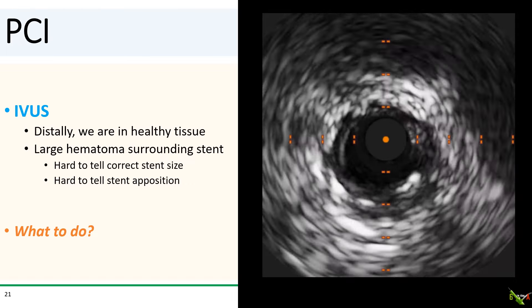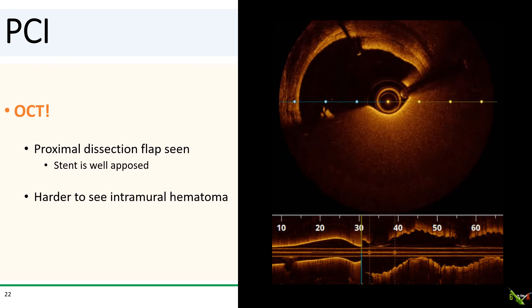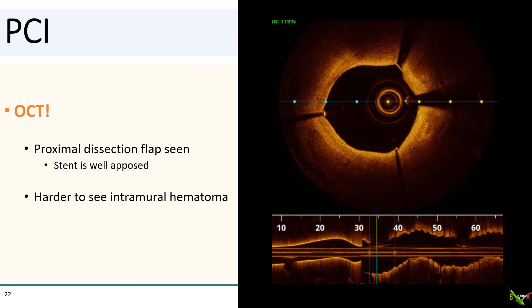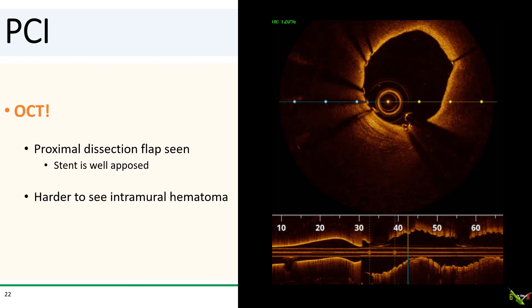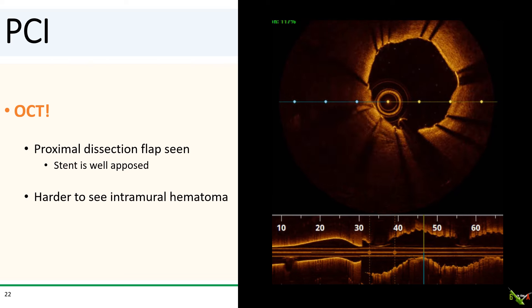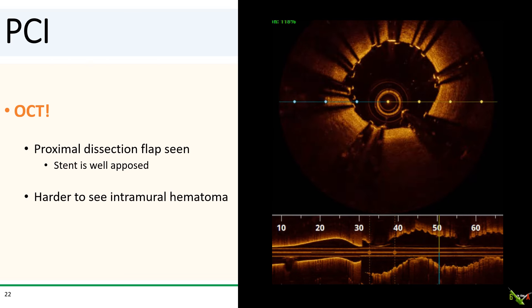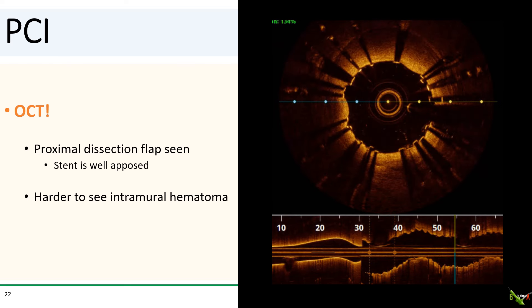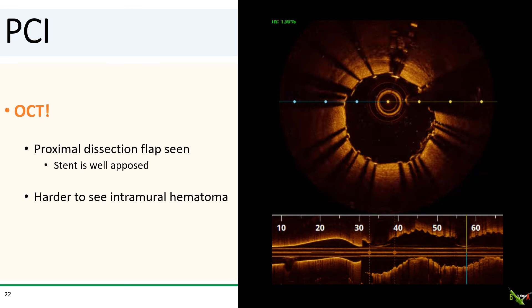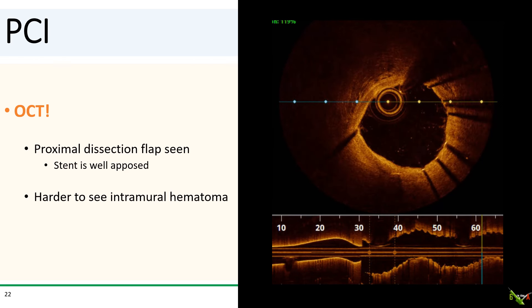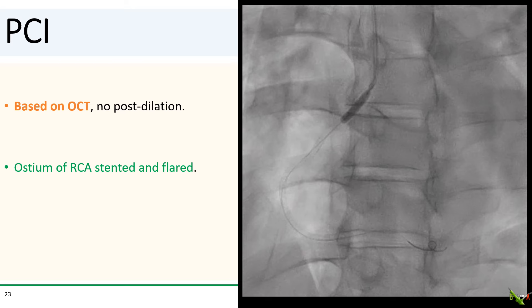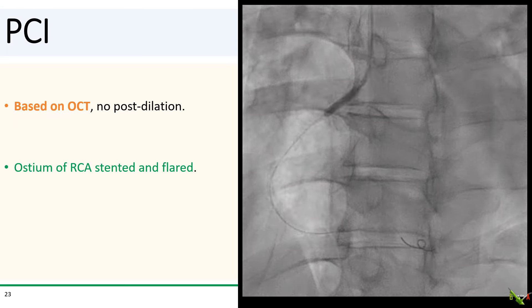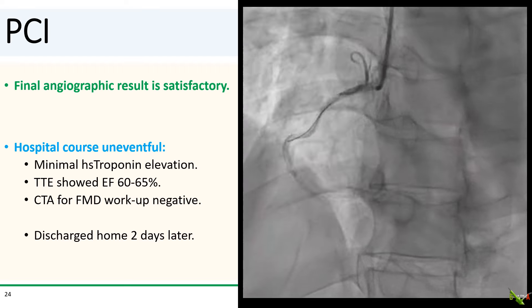I reached for the other intracoronary imaging modality: OCT. Here's the OCT run. There is, in fact, a proximal dissection flap — this could have happened with the guide, but I suspect it happened with the stent tearing the bulging intima as it was being deployed. Overall, the stent did appear to be well-sized and well-apposed. It's a little harder to see the intramural hematoma on OCT compared to IVUS — you can make it out, but it is more subtle. Based on the OCT images, I did not think I needed to post-dilate any further, but I did need to stent the proximal edge of the vessel.